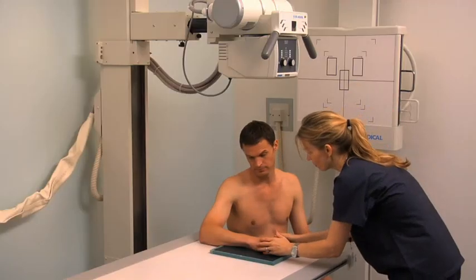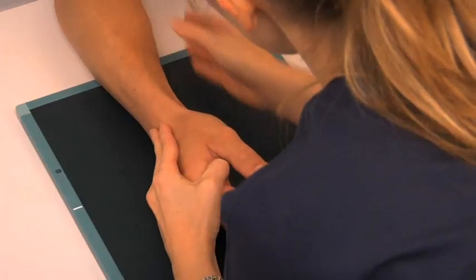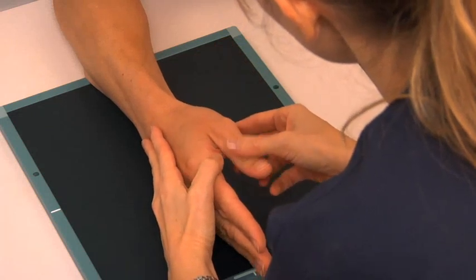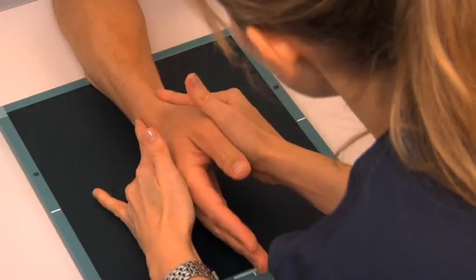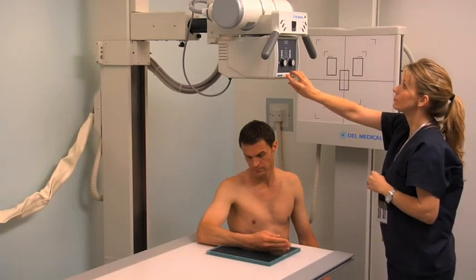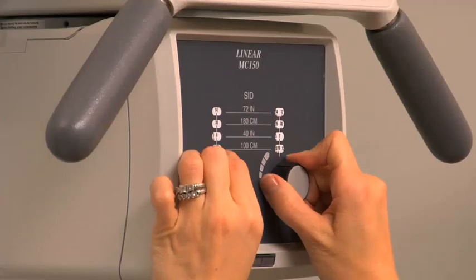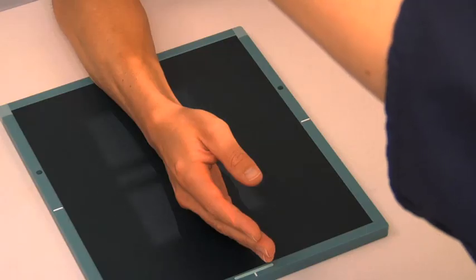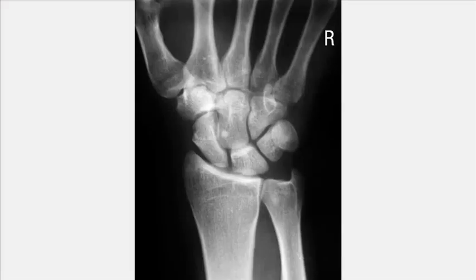Place another cassette to obtain a lateral projection of the wrist. Rotate the patient's forearm laterally so that their thumb is uppermost. Gently palpate the radial and ulnar styloid processes to confirm superimposition. Align and center the central ray and collimate the light field the same as for the PA projection. Expose the cassette and review the images of the wrist.